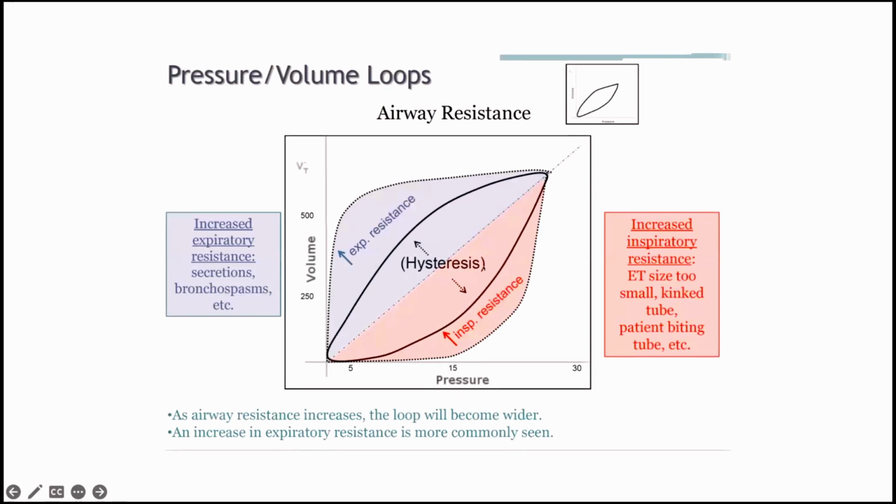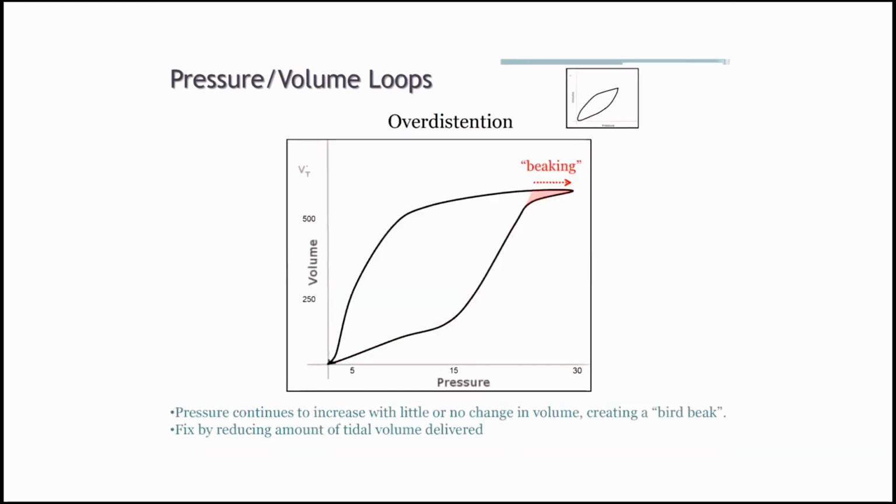But most of the time, we can get this information from the pressure time curve. We know that when you have an obstruction, the plateau pressure is going to remain almost the same, and the peak pressure is going to go up. So naturally, the difference between the peak pressure and plateau pressure will be significantly increased, as mentioned by Dr. Vivekanandam and Dr. Sunil. And this is another classic exam point of view, the pressure volume curve.